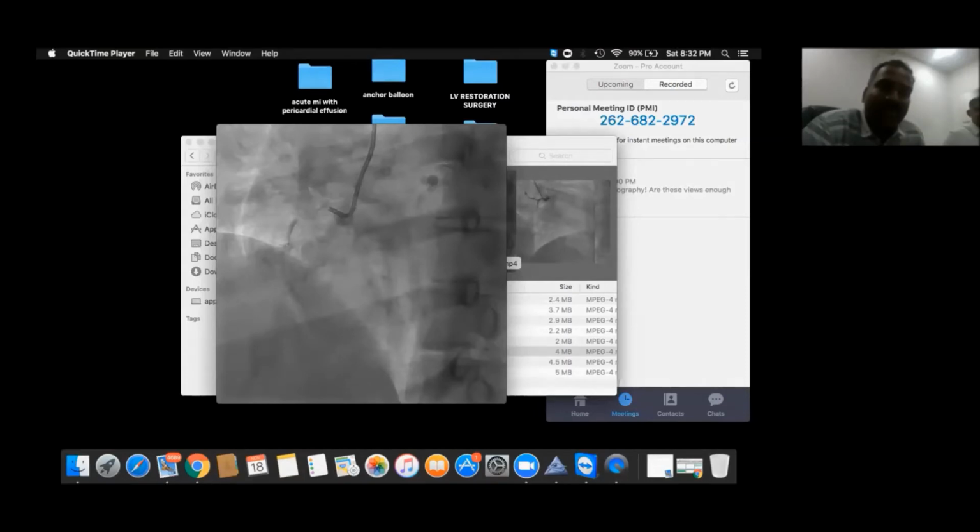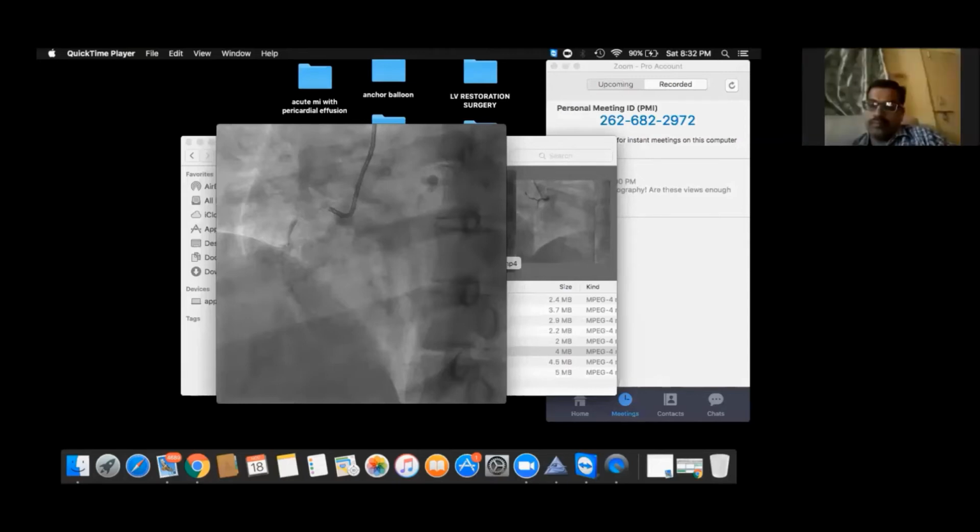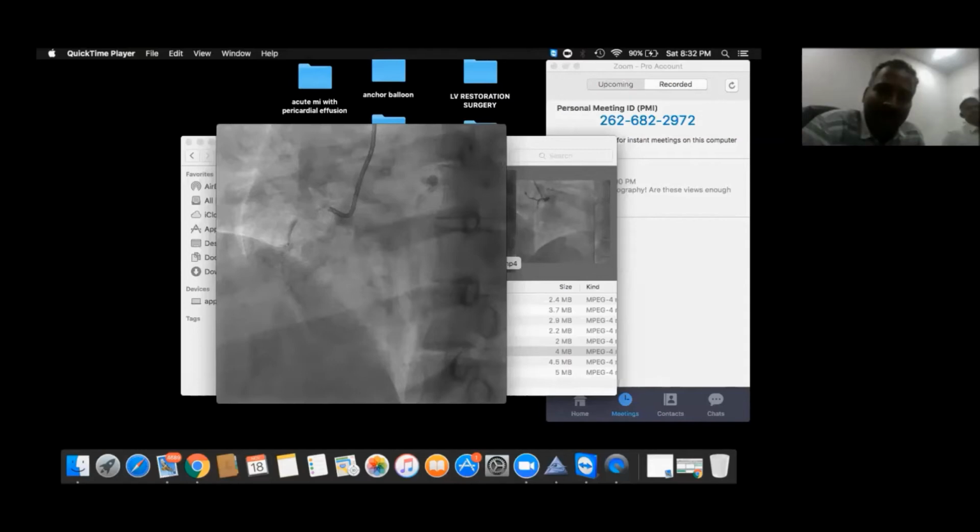presentation. For left-sided venous grafts, always after doing a native angio, most often you will go with femoral only in these cases. After completing your femoral native LMCA angiogram, that is the native left system angiogram, you pull your JL back, turn it a bit anteriorly and try to engage. If it doesn't happen, pull that catheter out. Then again, try with MPA.